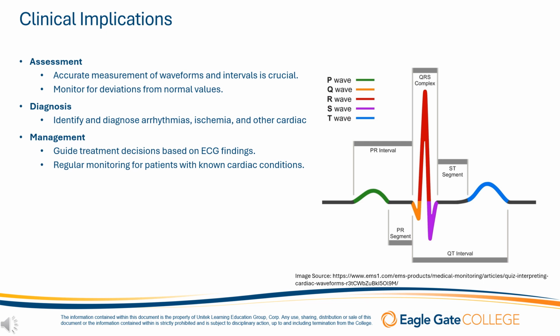We obviously need to do things like monitor QT interval for patients on drugs that can prolong it. Patients with pacemakers or ICDs need regular ECG monitoring to ensure that the devices are functioning correctly. And post-surgical cardiac patients also require consistent ECG monitoring to detect potential complications.